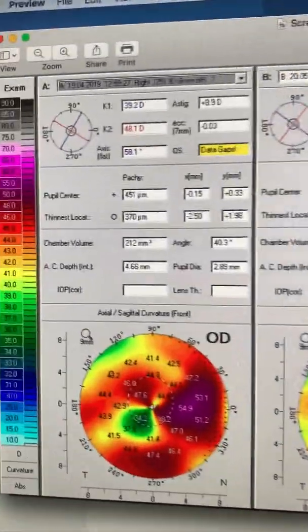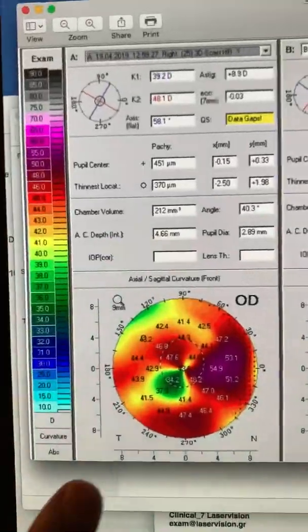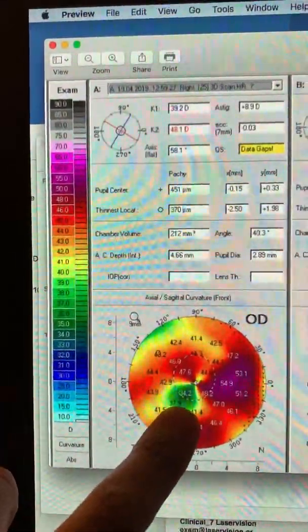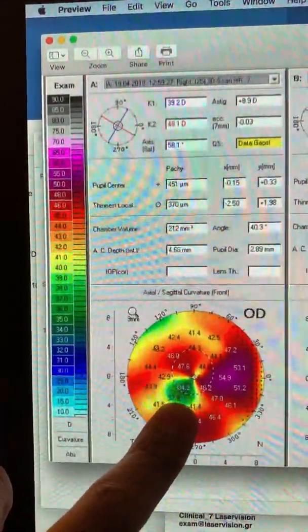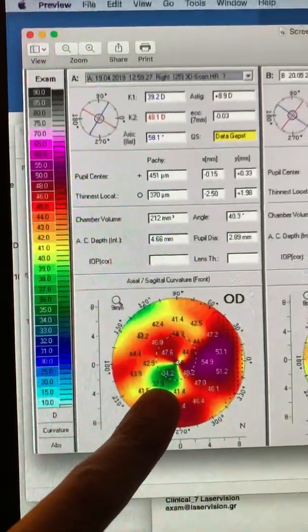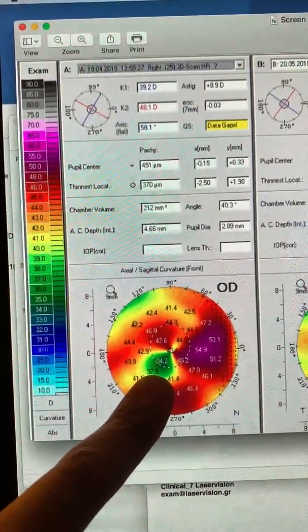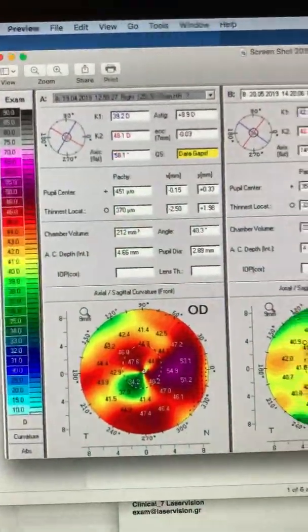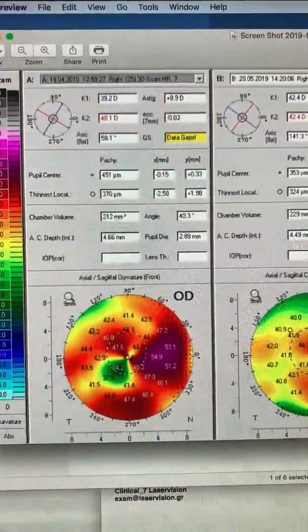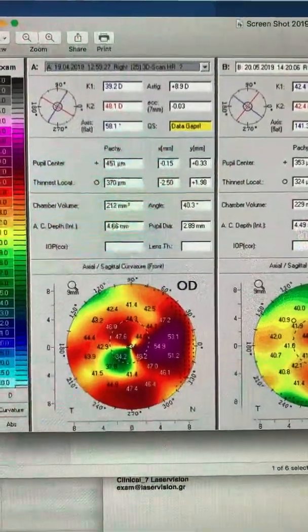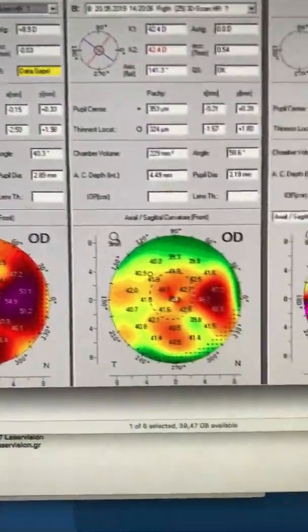These are the pentacam maps and you can see here the significant irregularity in the inferior temporal part of the cornea. We can see topographically significant irregular astigmatism, 8.9 diopters of astigmatism seen there.